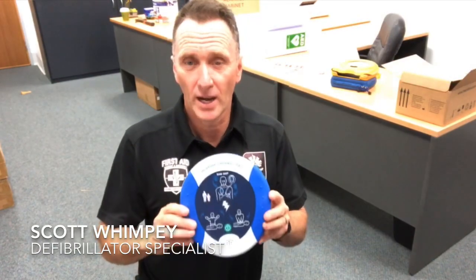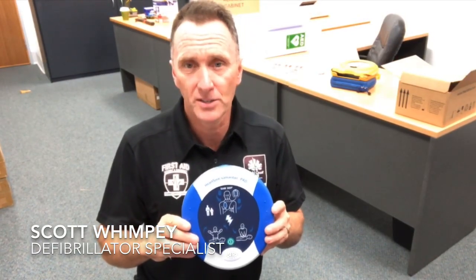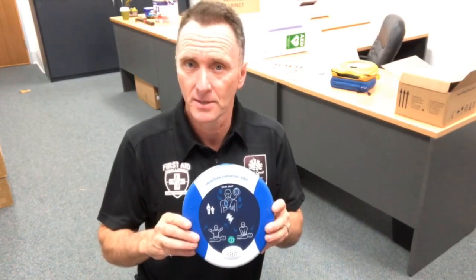If you have used your HeartSign 360p defibrillator, it's recommended that you change the battery and the pads. It's very easy to do and I'll show you how now.